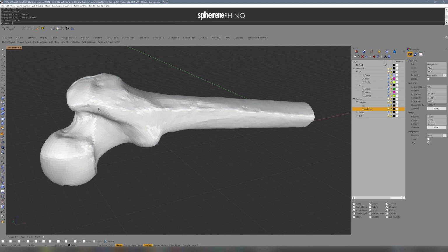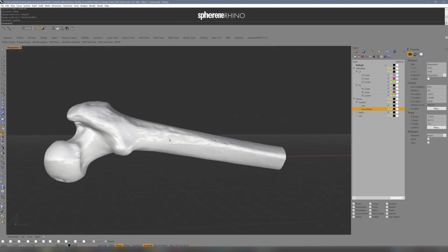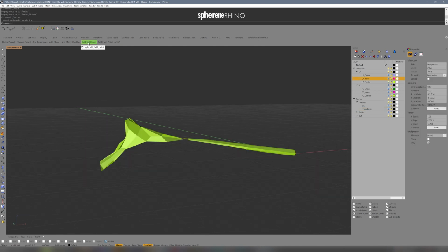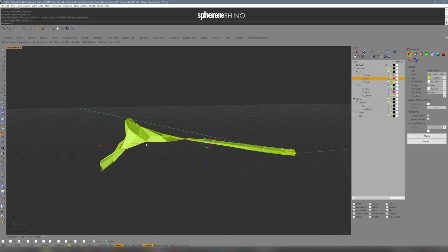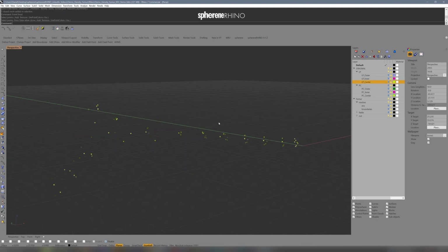I have a 3D scan of a femur bone cavity inside here. I quad-remeshed the whole and made a low polygon version. Normally I would place a density field point. Here I use these low poly geometries to do that. I use the point cloud command of Rhino to distribute points on each vertex of this geometry. Select this one, and now you see I have placed points that follow the volume of my dead geometry.